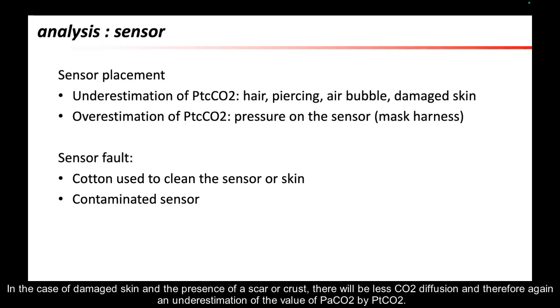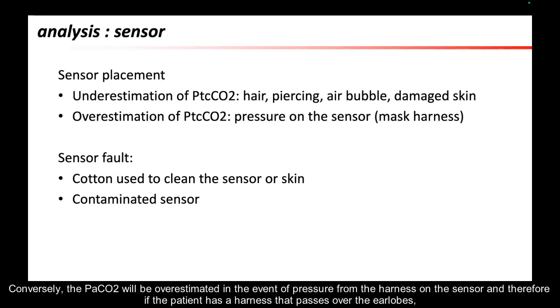In the case of damaged skin and the presence of a scar or crust, there will be less CO2 diffusion, and therefore again an underestimation of the value of PaCO2 by PtCO2.